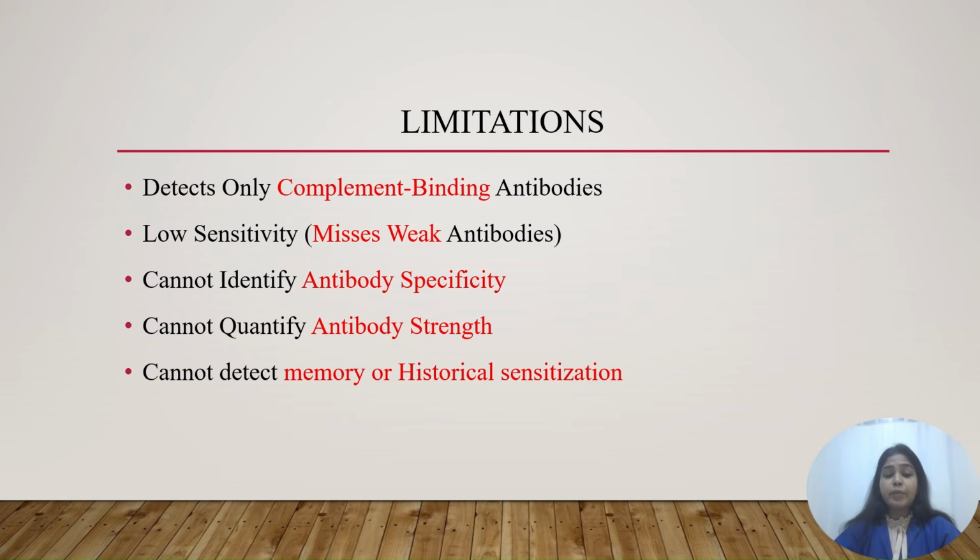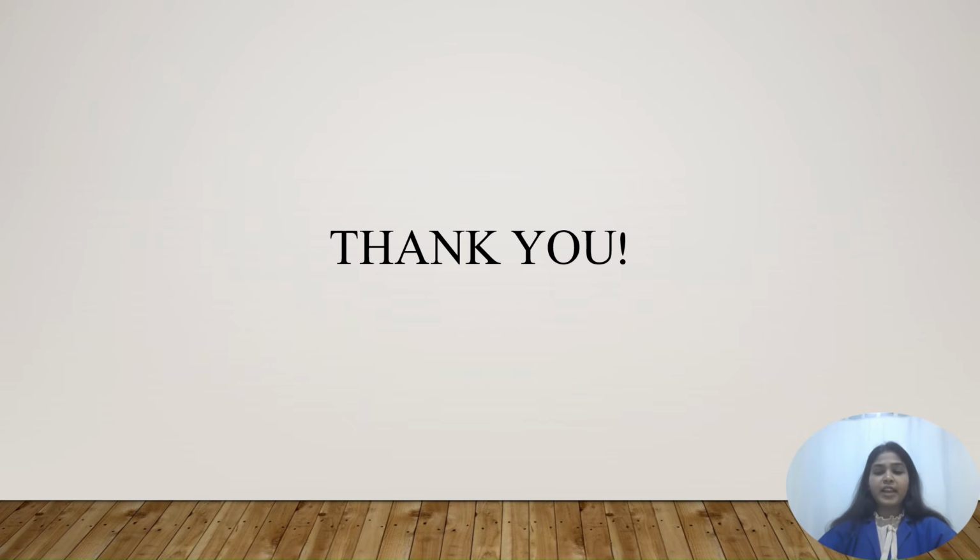It cannot detect the memory or the historical sensitization. Because it cannot detect this, we use antibody screening to detect memory or historical sensitization. So that was all about the limitations of the CDC crossmatch. Thank you and have a nice day.